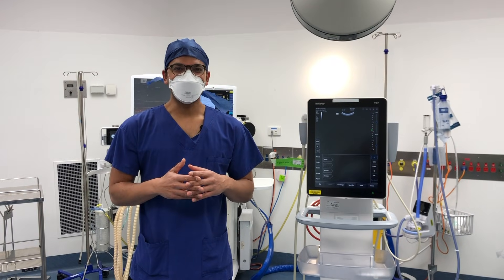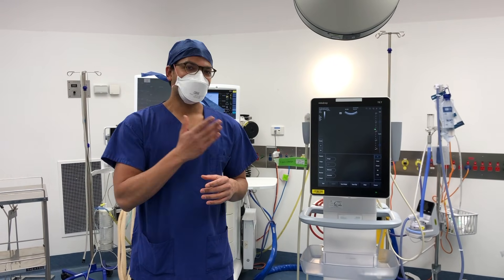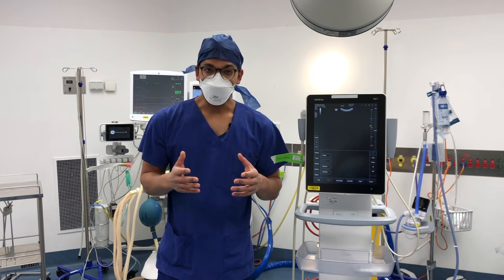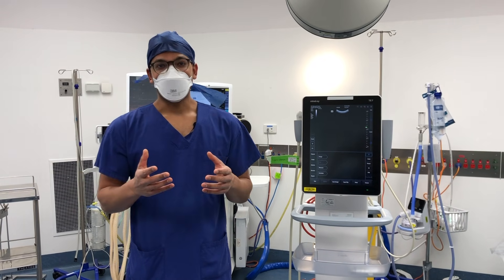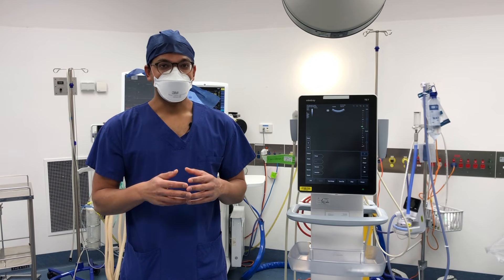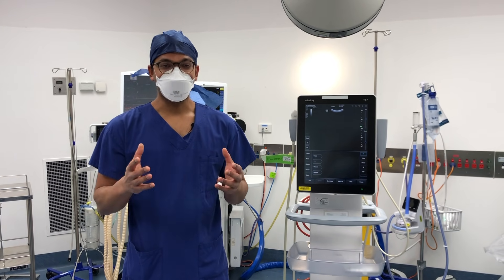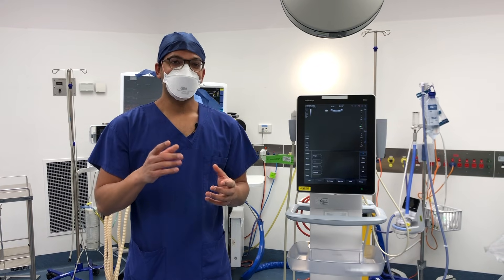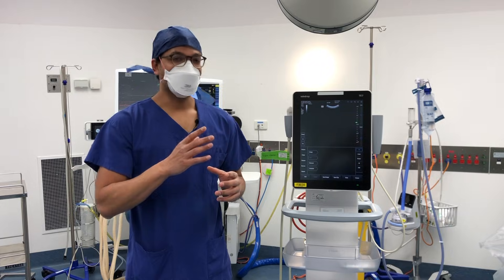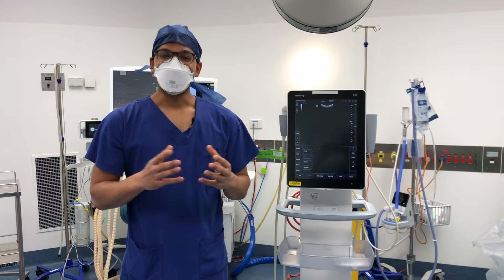Hi everyone, this is Lahir from ABCs of Anesthesia, and today we're going to go through ultrasound-guided intravenous cannulation. This is exactly the technique you want for the most difficult veins — sometimes your veins are deep, sometimes you just don't have many options and you want to get it right first time. We're going to use a structure called PP-DFG, and that's the way you get the best settings and the best view of your vein. Let's get started.